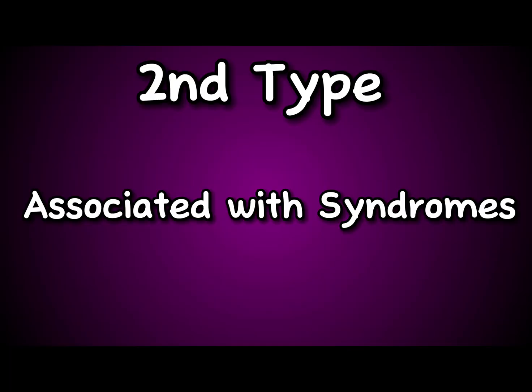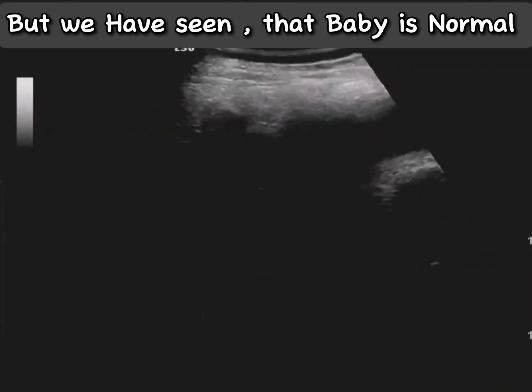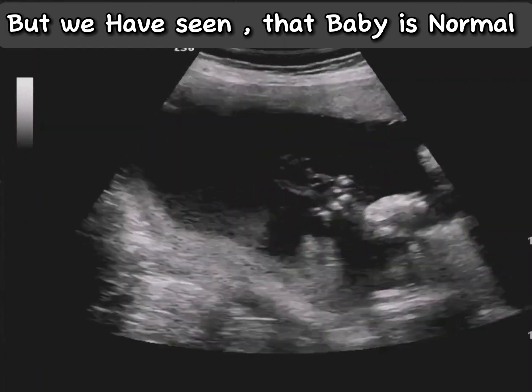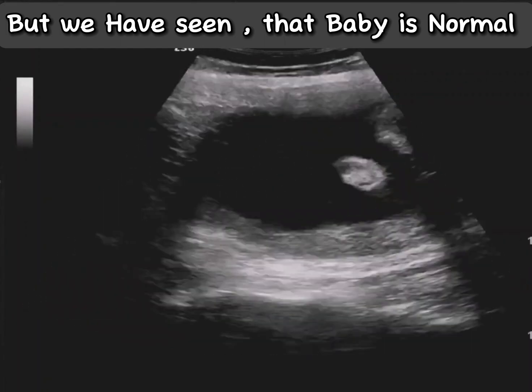The second type is associated with multiple syndromes. However, in this case the baby is normal and no other congenital abnormality is seen, so this is an isolated case of club foot.